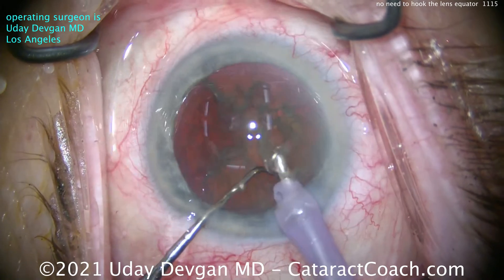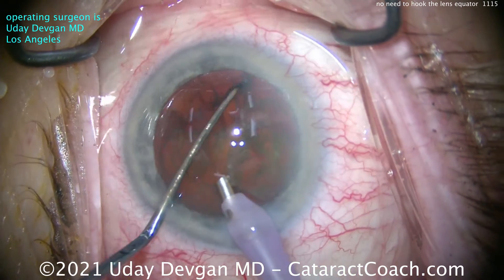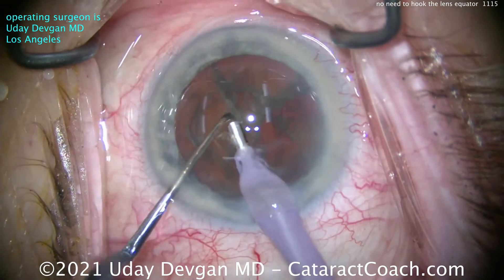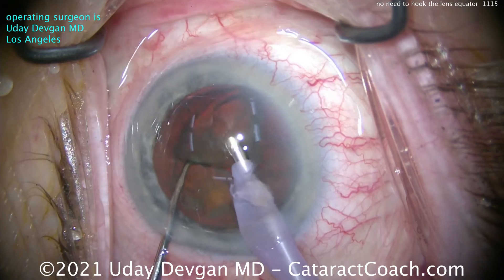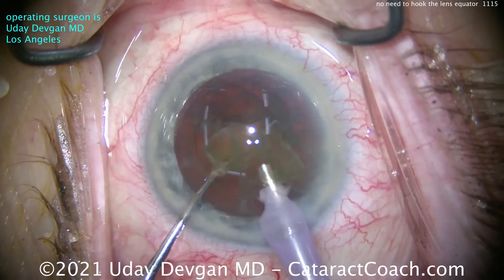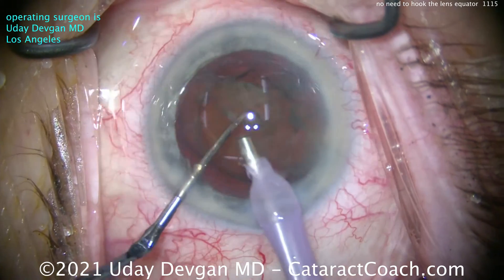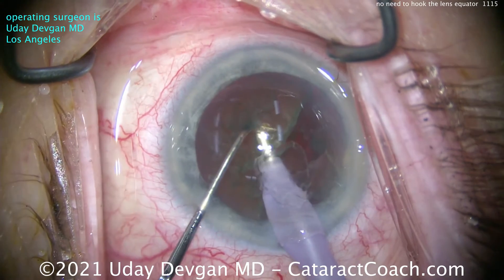Vertical chop keeps both instruments right there in the center and changes the force vector to a more vertical one. This is a combo chop — kind of a little bit of both, the best of both worlds. We can very easily chop this nucleus with moderate nuclear density, keeping both instruments, the phaco probe and the chopper, within the capsulorrhexis.